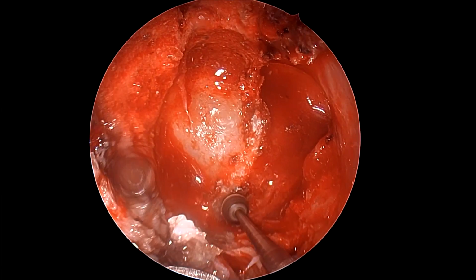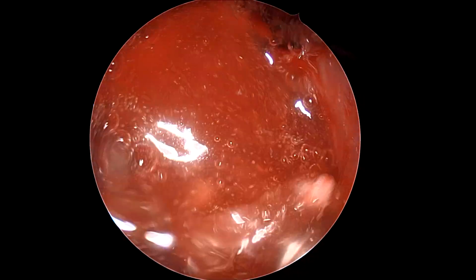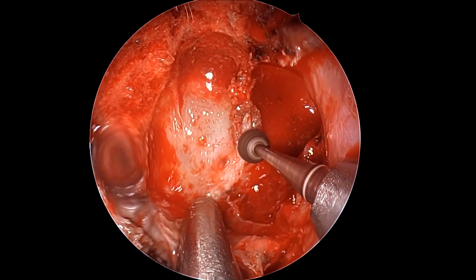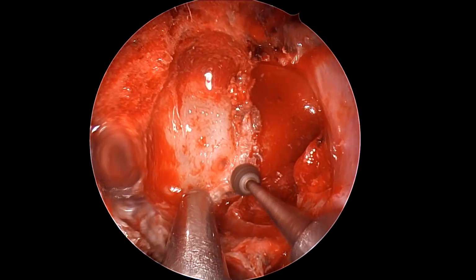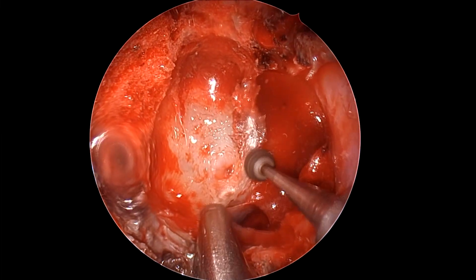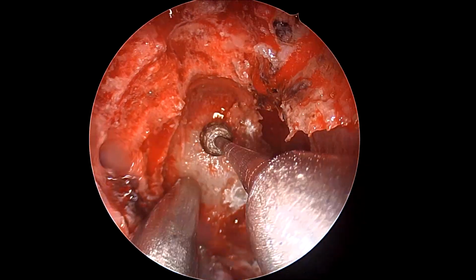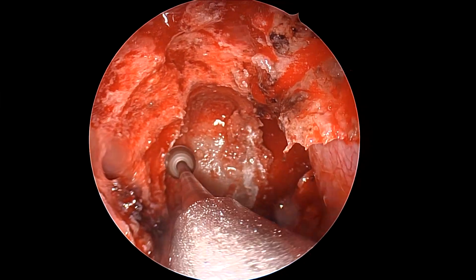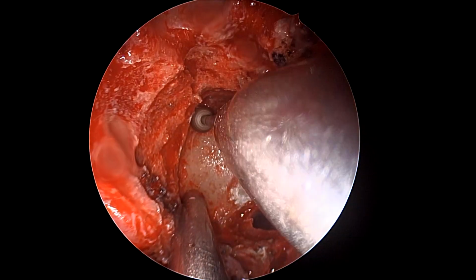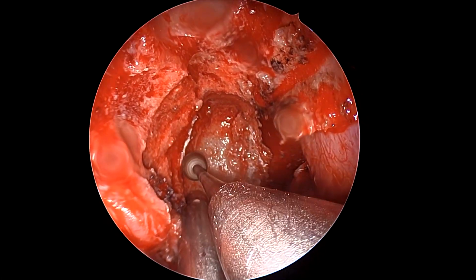So what we want to achieve here, what is the limit of drilling, is basically being able to see the floor of the sphenoid sinus and the clival recess. The clival recess, mind you, has been completely compressed because of the size of this sellar lesion. So in a compressed clival recess, what you can see down there, we have to expose it because we have to find the floor of the sella, completely expose it before we try to open the sellar periosteum and the dura.